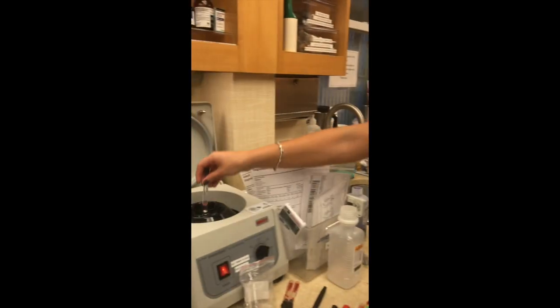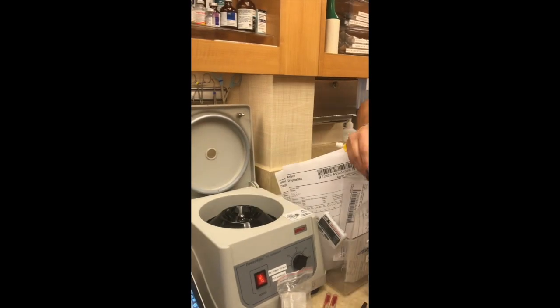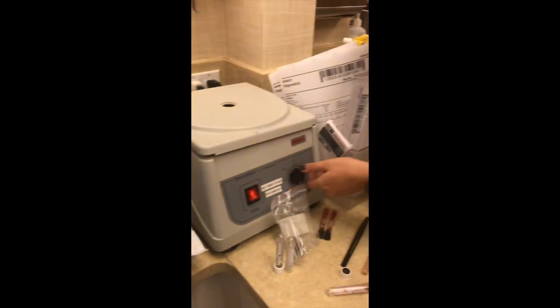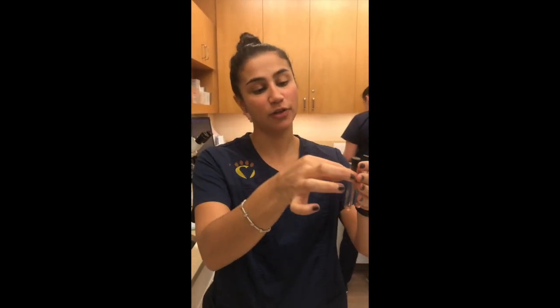Okay, so now we've waited 30 minutes. Now we're going to spin all 4 of our tubes for 1 minute. Okay, so now I have our major and our minor tubes. So first I'm going to tap on each of them and look for agglutination and hemolysis.